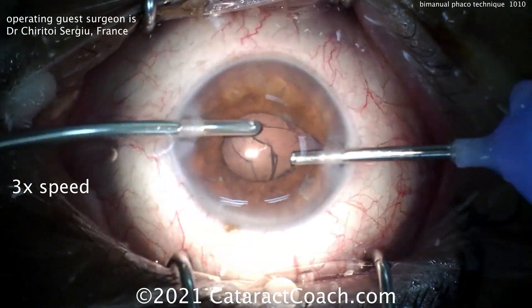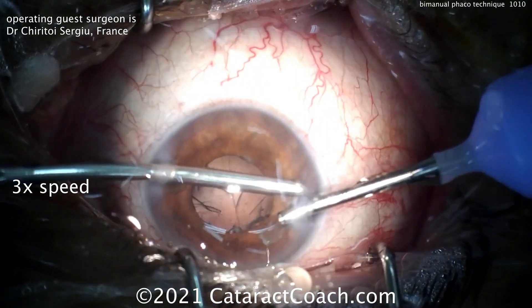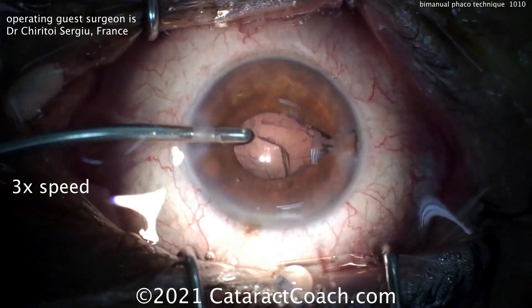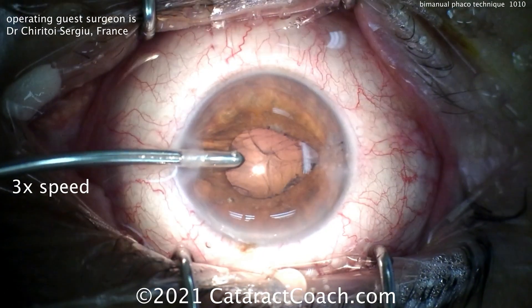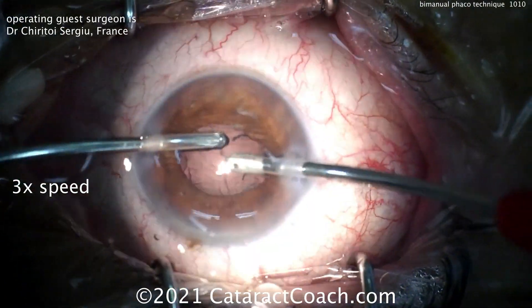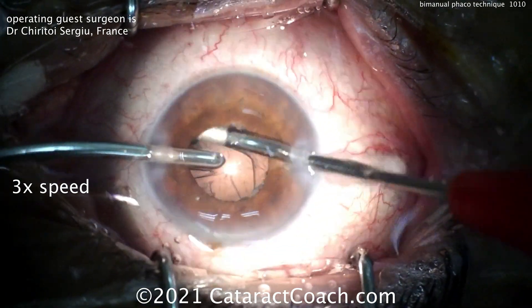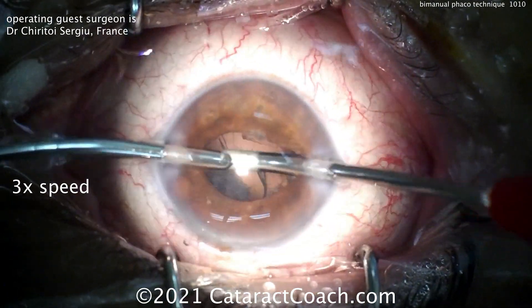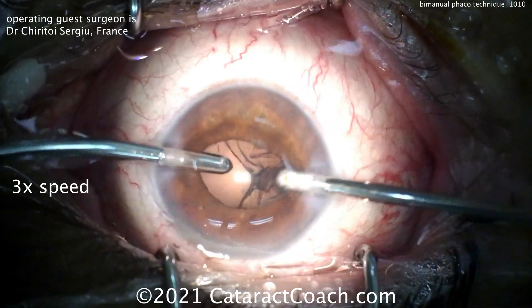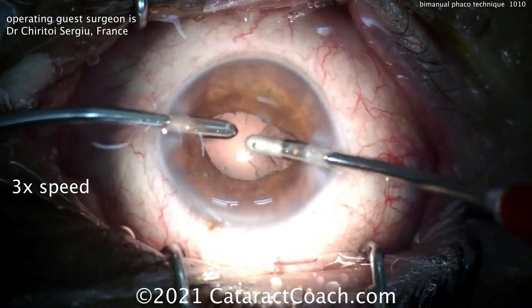You may also need to use a different instrument. If you're going to use a chopper, it has to be an irrigating chopper. In this case, our surgeon is doing a stop-and-chop-based approach, dividing the nucleus with one groove down the middle and then splitting it manually. With the infusion staying inside the eye in the left hand, the right hand uses a smooth aspirator to remove the cortex — that's bimanual cortex removal.